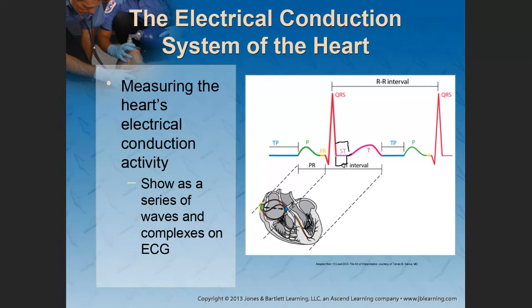If it's elevated or depressed, it's an indication of a myocardial infarction or myocardial ischemia. It means that something is wrong with the heart muscle in terms of it getting its proper perfusion. So that's the ST segment. Let me clear that.